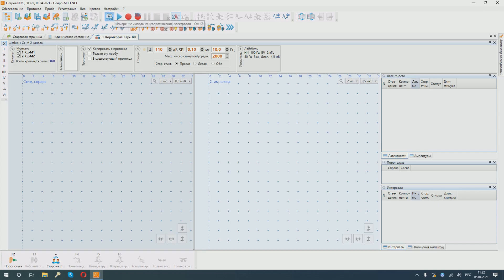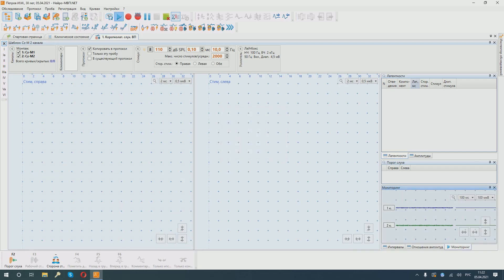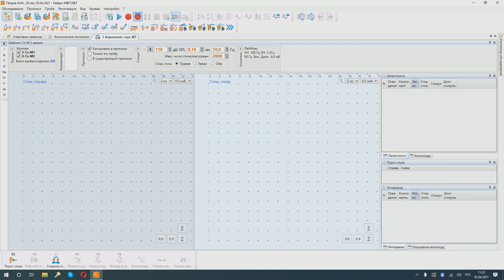When the patient is prepared, we checked the impedance. We are within two. Everything is good. Let's see the monitoring signal. Calm. We can start stimulation. We start from the right side.